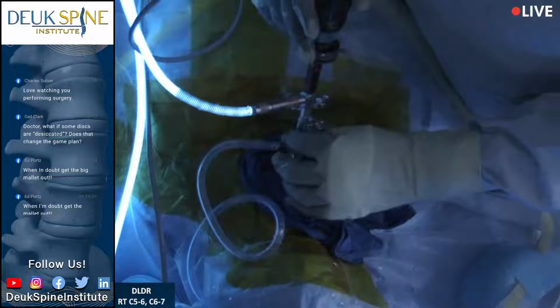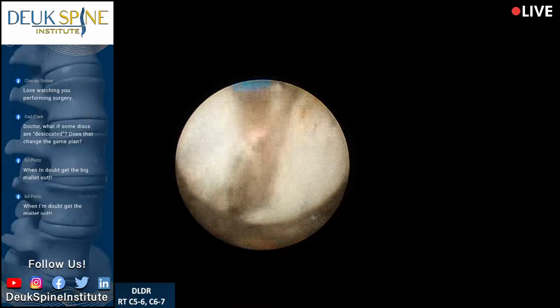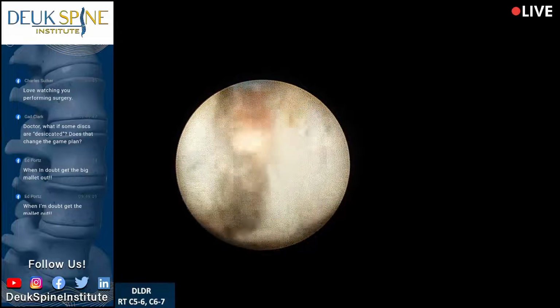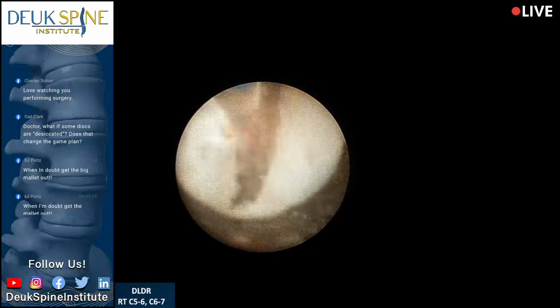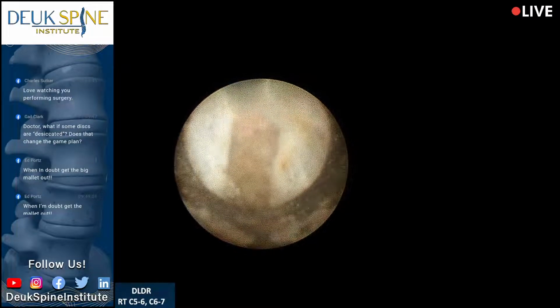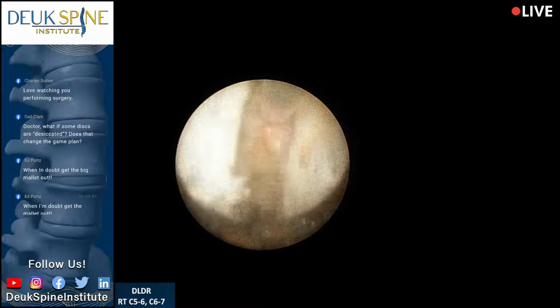So back to the laser. You can see there's a herniation still right there, and it's not coming out easily, so we're gonna just blast it with the laser. The laser works by delivering a lot of energy to tissue, and then that causes the covalent bonds that hold proteins together to rupture, to break apart, and that allows the tissue to basically break apart into small pieces. That's why you can take a big piece of herniation and turn it into a couple of small pieces of herniation. It's kind of like shooting a laser beam at an asteroid, and it breaks it up into little pieces.